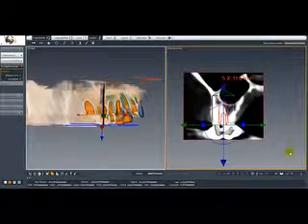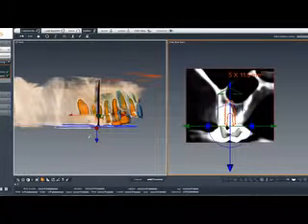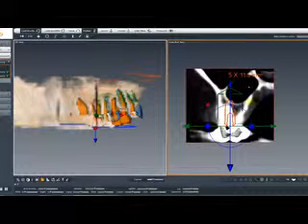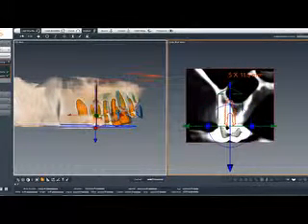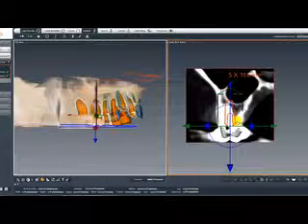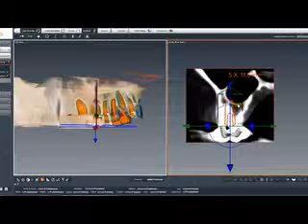So I'll start with tooth number 3, and as you can see over here on tooth number 3, I'm putting it right in between the roots that are in there, and I'm going to propose a 5.0 by 11.5, and as you can see, it's going to go right up into the sinus area in here. We could easily put a 6.0 as well if need be to get some good initial stability in there, but I'd like it to engage to the subfloor of the sinus area right there. So you will be able to use either a 5.0 by 11.5 or a 6.0 by 11.5 on tooth number 3.